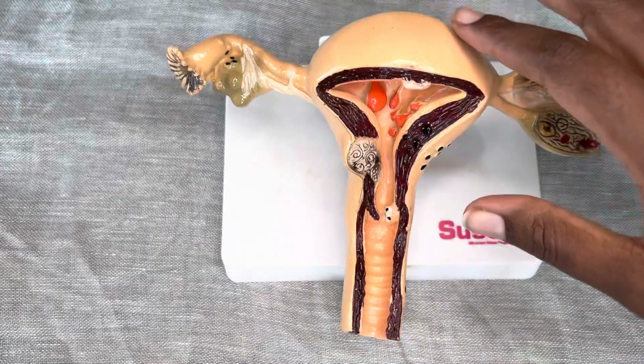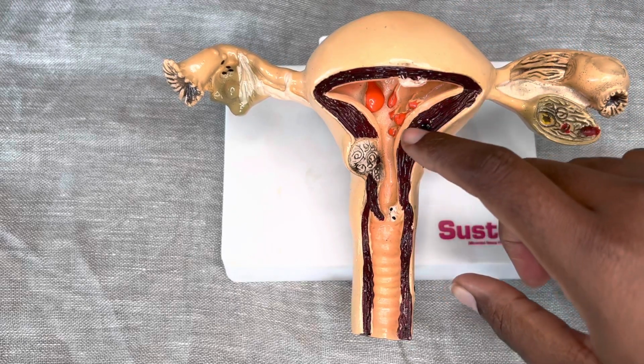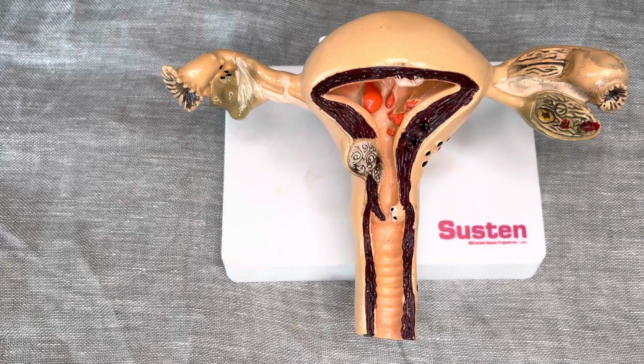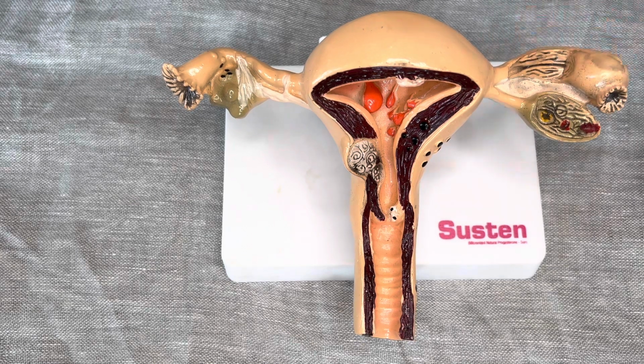This is the fundus of the uterus. This is the actual uterus. This is the muscular layer of the uterus. And then this is the endometrial layer of the uterus. That is where it normally sheds during your period and you get your period. And then this is the fallopian tube, the place where we say fertilization starts, or happens there. And then this is your ovary.